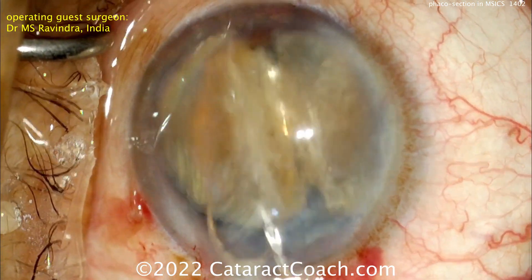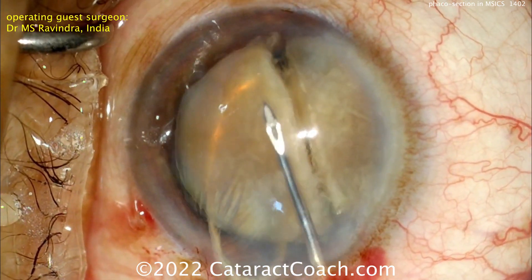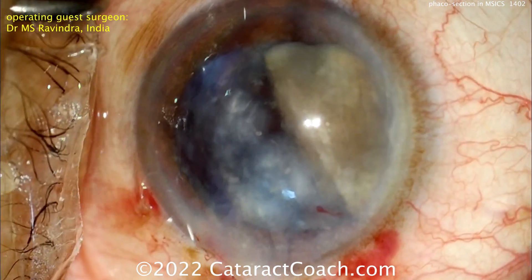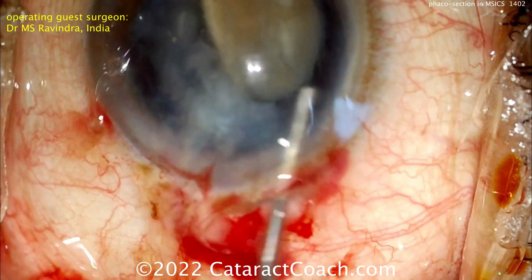Now each half can be removed. Look at this technique — using that cystotome to help sandwich it and hold it down so you don't scrape the endothelium. Removing that first half just like that — easy. More viscoelastic — viscoelastic is always your friend here.